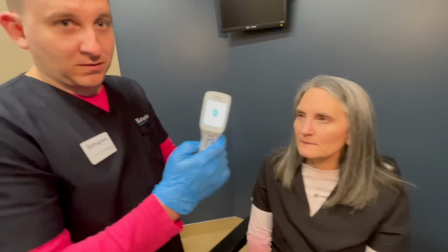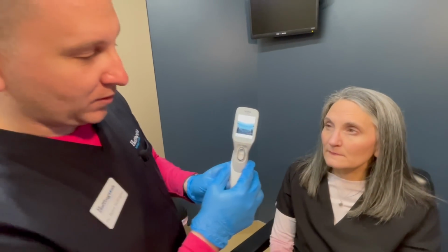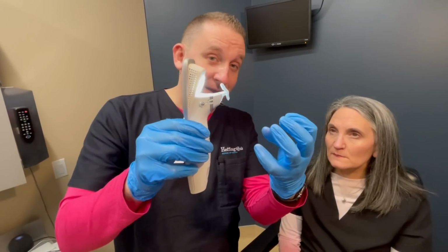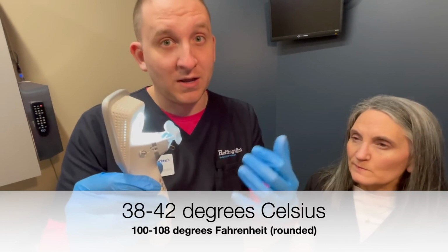So how this works, there's a little digital pop-up screen display that we're going to be able to look at and see how we're lined up with her eyelids. But this little device here is going to grab and heat up the eyelids to about 38 to 42 degrees Celsius, also known as 100 to 108 degrees Fahrenheit.